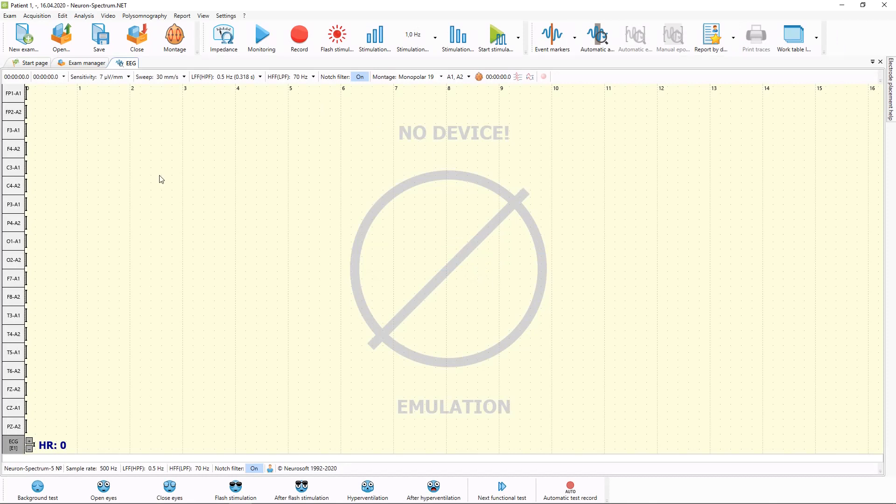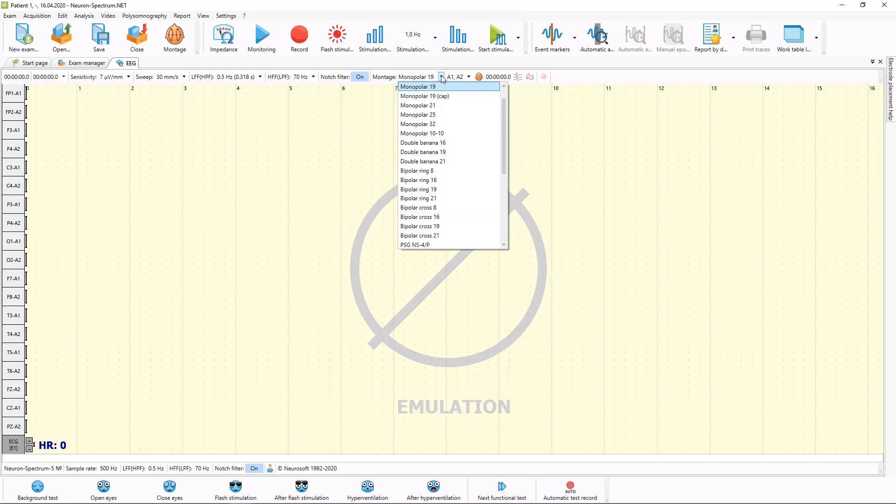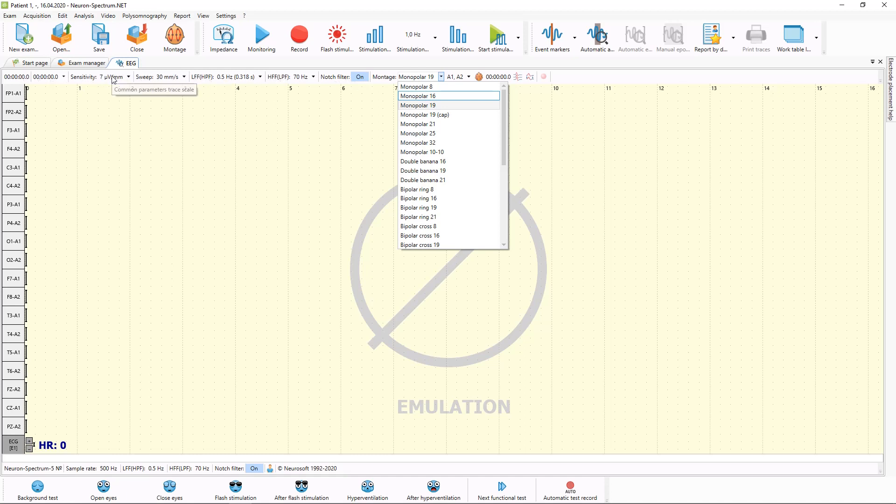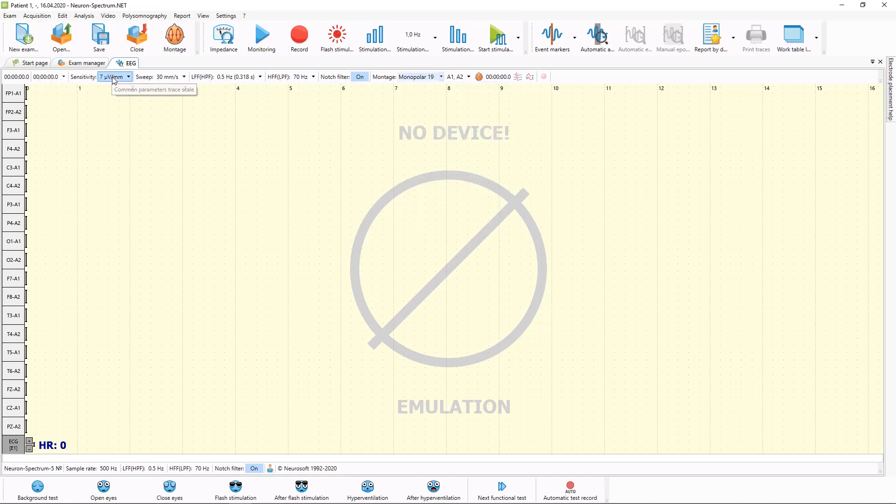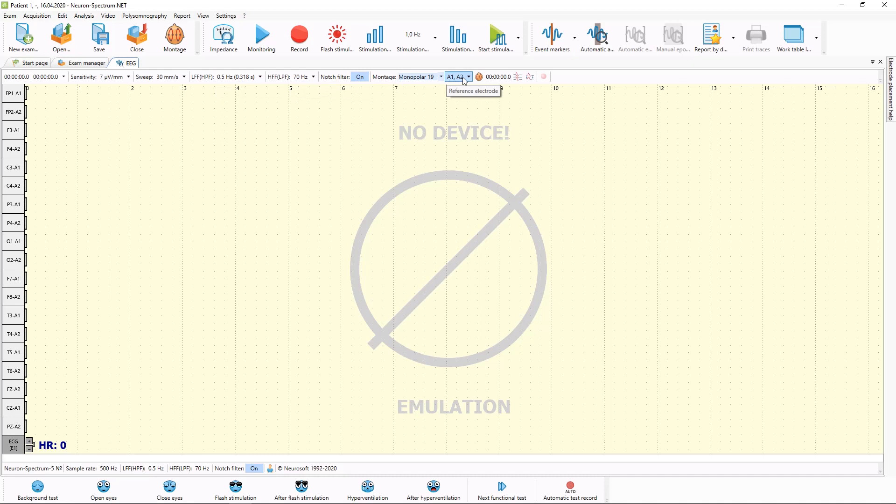You can see empty traces which are located from the left side according to current montage. You can select another montage before or during acquisition. Also here in acquisition toolbar, you can select sensitivity of the traces, sweep speed, filters and referent electrode.